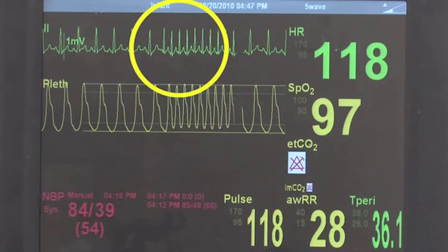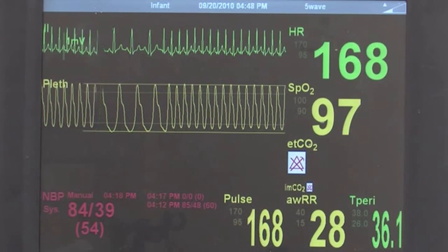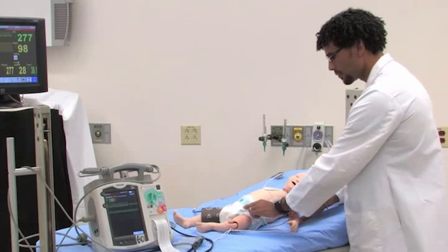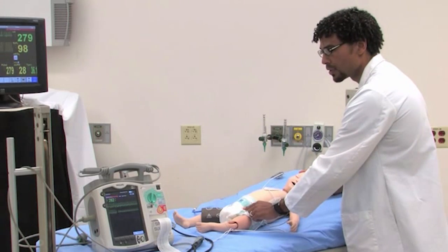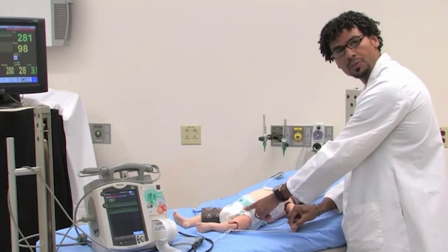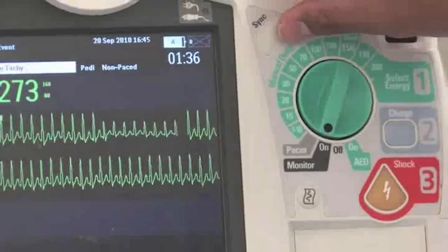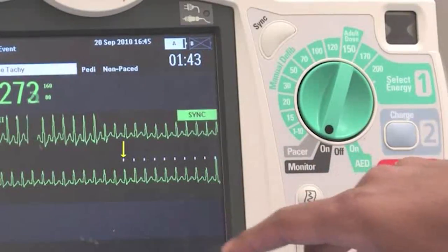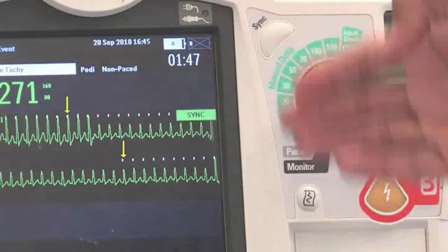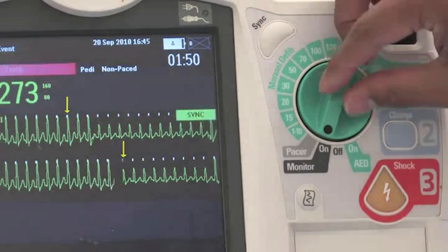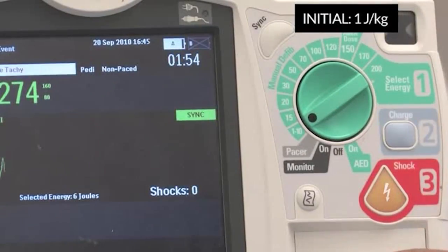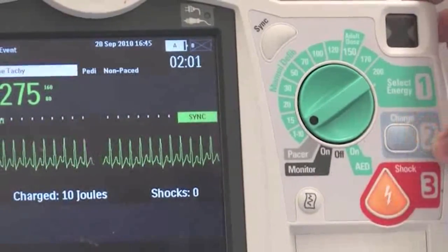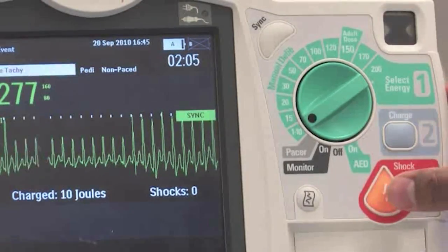We start off with a hemodynamically stable patient and we have an acute change in the rhythm. We look at our monitor and we have a narrow complex tachycardia at a very high rate. We quickly assess the patient's hemodynamics — the patient is not responsive, the pulse is progressively getting weaker, and capillary refill is poor. Our first step with synchronized cardioversion is to press sync, watch our monitor and make sure that the synchronization spikes — those little white dots — are occurring over the R-wave of our QRS complex. We select our voltage; our initial voltage is going to be 1 joule per kilogram, which I've dialed in. When I'm happy that the machine is synced, I charge — I'm clear, you're clear, we're all clear — and I deliver my shock.